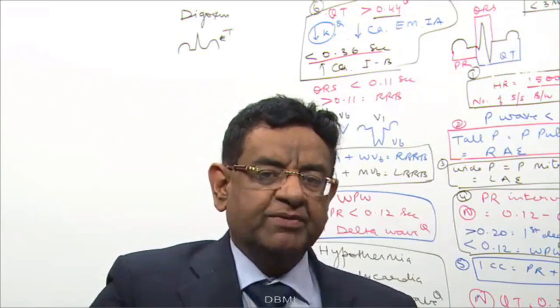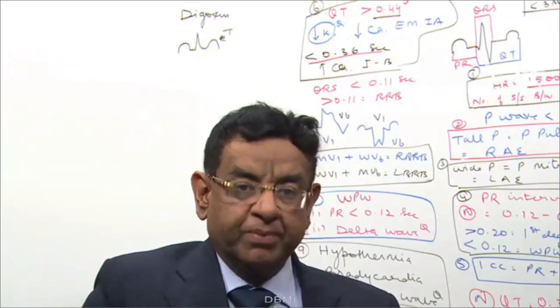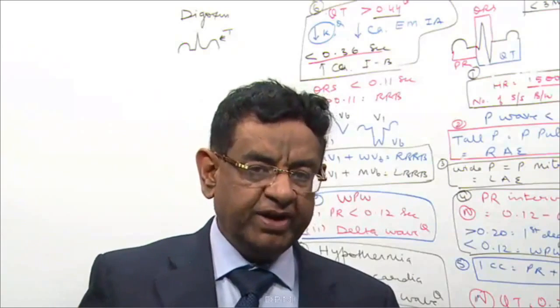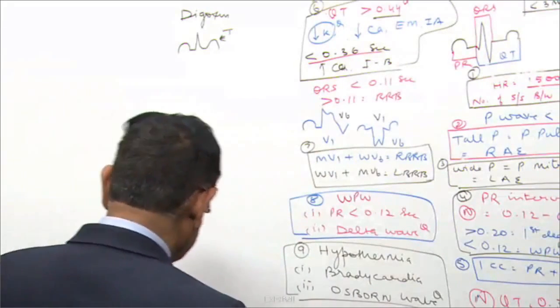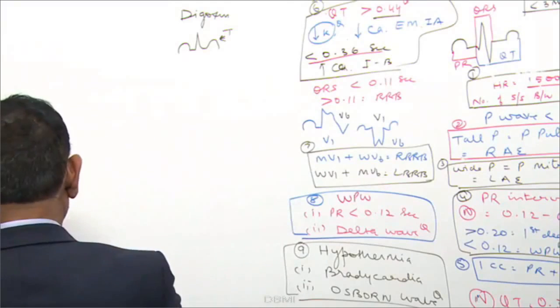He comes back to me after 1 month and he says, doctor, I am much better. My condition is much better. I feel much improved. So as a clinician I can understand he has been adequately digitalized. Now if I do the recording, then the recording becomes like this.